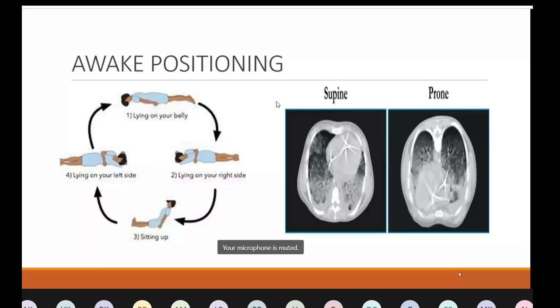Second last slide. What are the complications you are expecting? Choose the right mask, choose the right size, choose the right fit. The answer for all leaks is not to increase the headgear tension. There was one patient who died, who was saying to his family members that the only thing doctors do is they come and tighten my headgear and go away. So maybe what has to be done is to loosen the headgear, and then it will actually decrease the leak. That's what, at least theoretically, the textbooks say, and I think that's right.